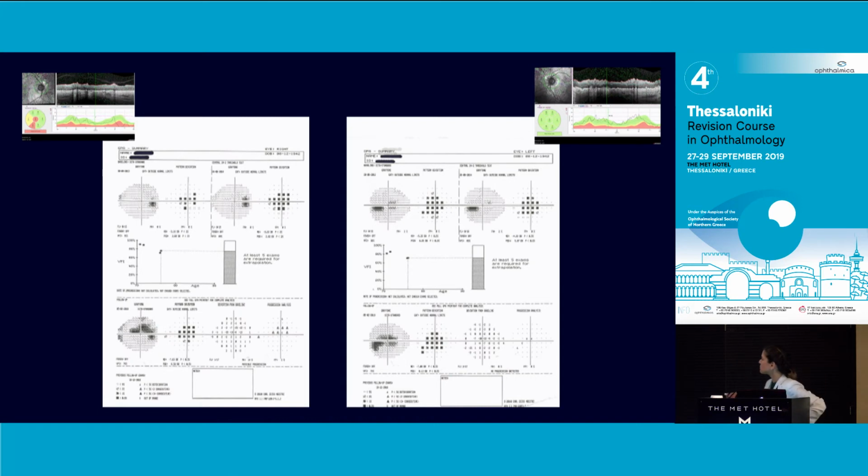Here's the problem. These visual fields at the top are a lot better than the bottom. But if you look at the VFI, there seems to be some space between the two. And then I realized that these were some years apart, because the patient disappeared and then came back. So I wasn't quite sure what's happening here. It looks like not very suspicious progression there, but that's going down at the same time. So you cannot just rely on this and say there is no definite progression, my patient is fine. You have to consider other things as well. Plus, the pressure is high now.